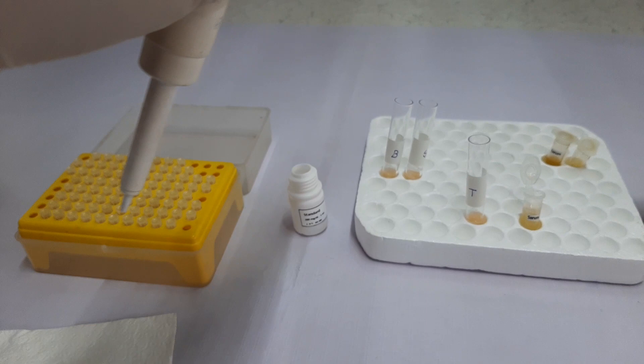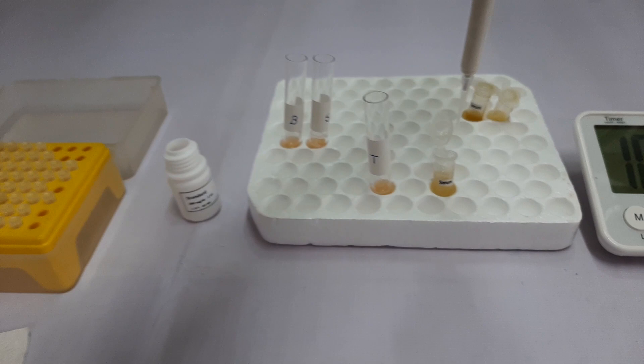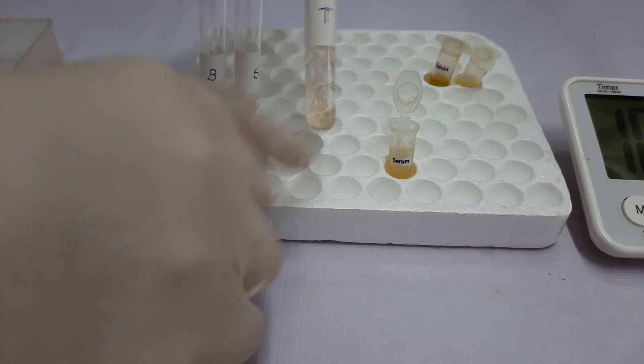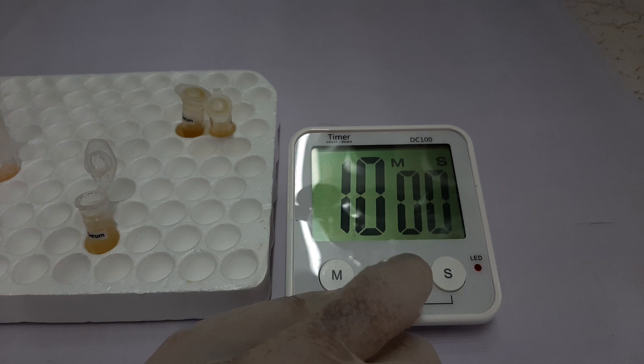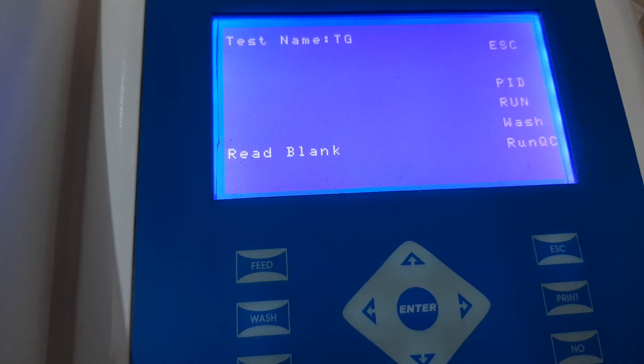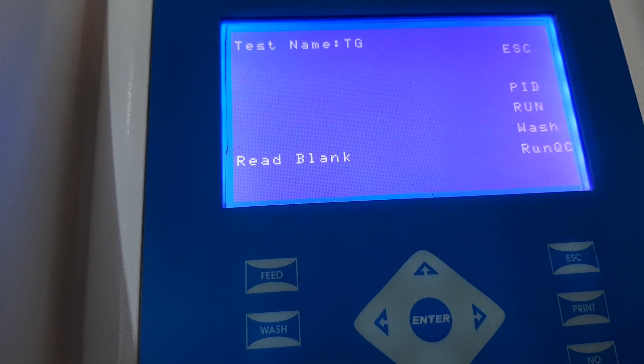Then we will change the tip and take 10 µL of patient sample. Wipe the outside of the tip with a tissue paper and add it to the third tube labelled for the test. Mix the components of the tube, and then we will incubate it for 10 minutes at 37 degrees Celsius.